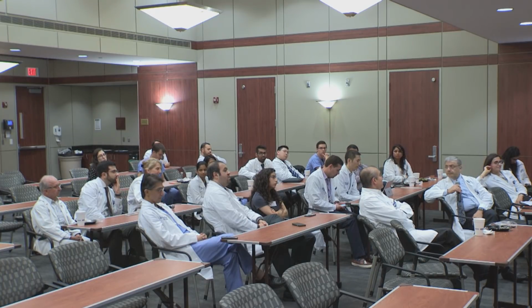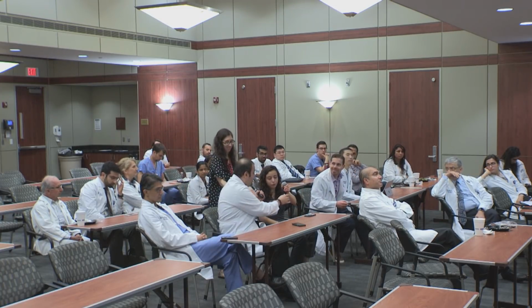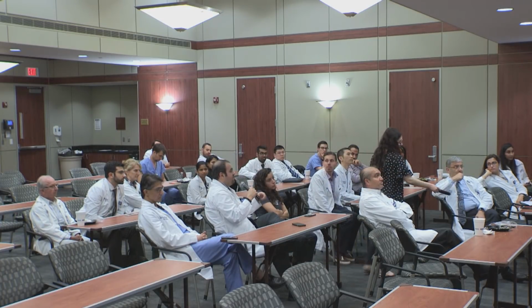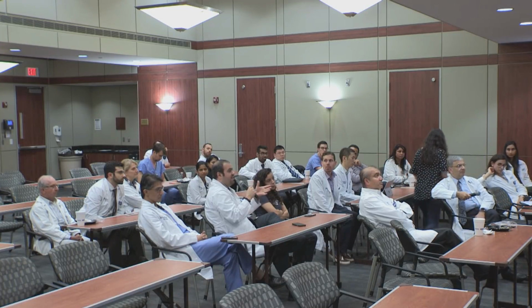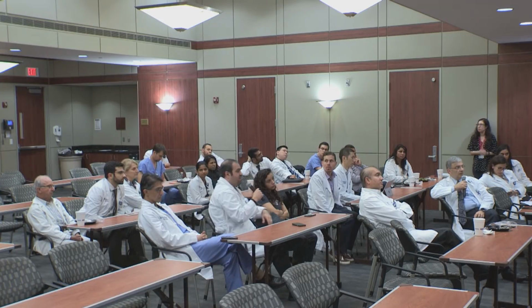Almost always when you see this tricuspid valve kind of adhesive to the septum, in people with membranous VSDs, this is how they spontaneously close. The septal tricuspid valve starts to adhere with age to the septum, and then it becomes almost adherent. And sometimes, whenever you're seeing this concomitant bulge, as Dr. Kumar said, you really want to rule out a defect, which I think probably the saline would have.